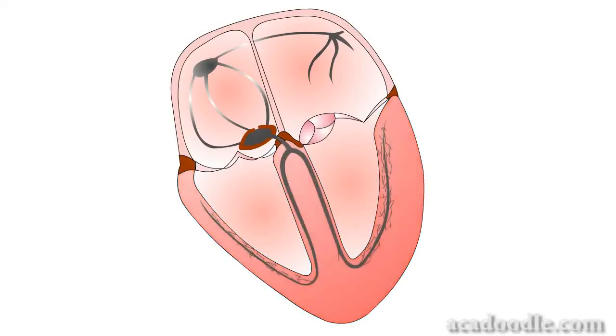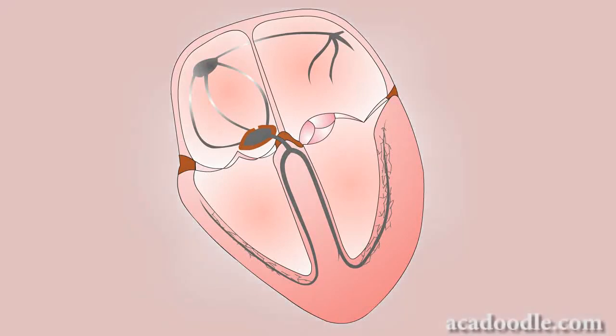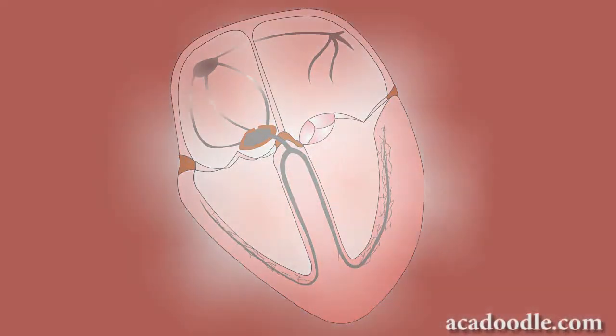We will now go on in video 2 to show you how the depolarization and repolarization waves are analysed to produce the normal ECG readout.